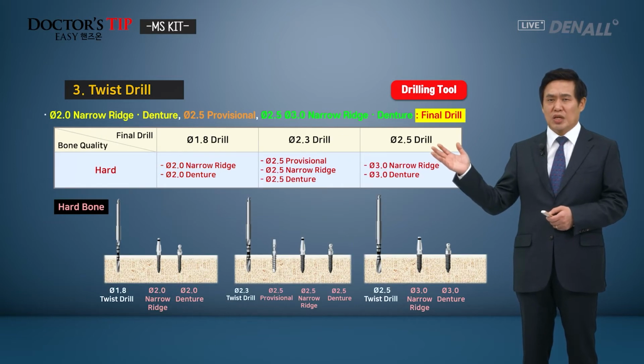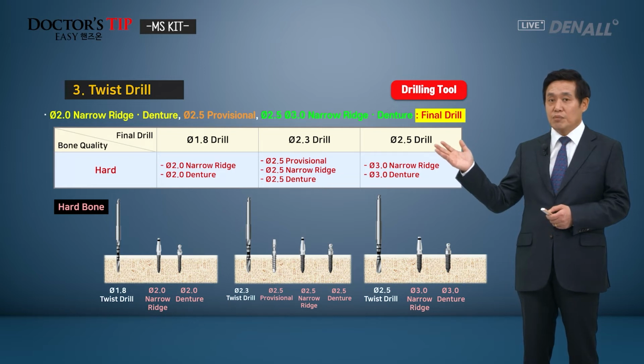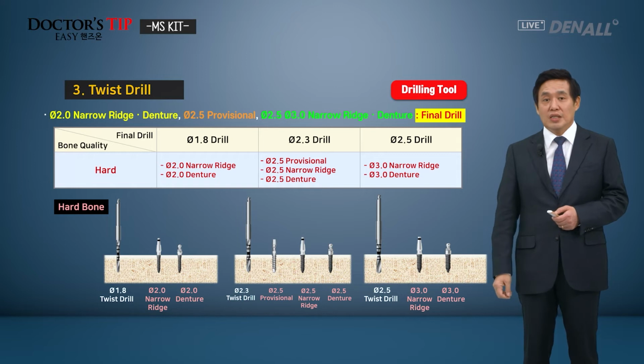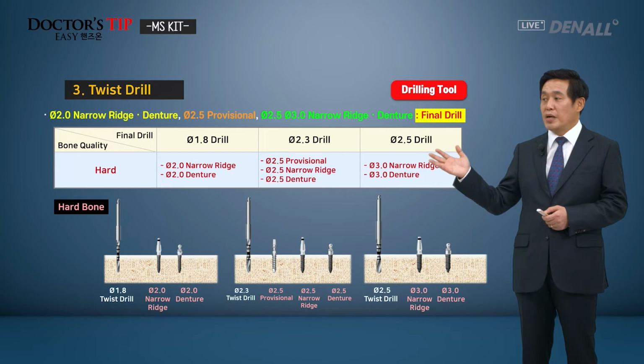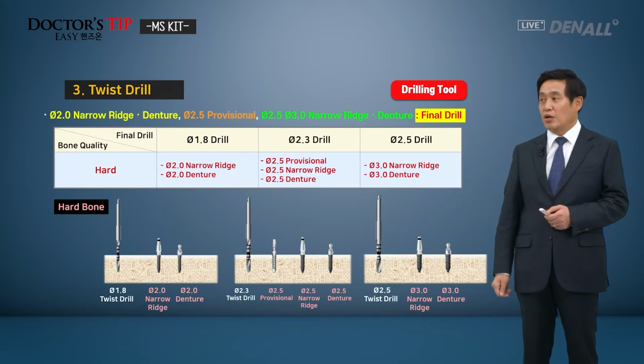And in the mandible anterior, it's very hard bone. So in such cases, for 2.0, maybe final drilling is 1.8, and for 2.5, maybe 2.3, or for 3.0, a 2.5 drill. So my experience is, even if it's hard bone, rather than use the final drill in full length, use a shorter one. So in the MS implant, in the 1x fixture, initial stability can be adjusted by you.